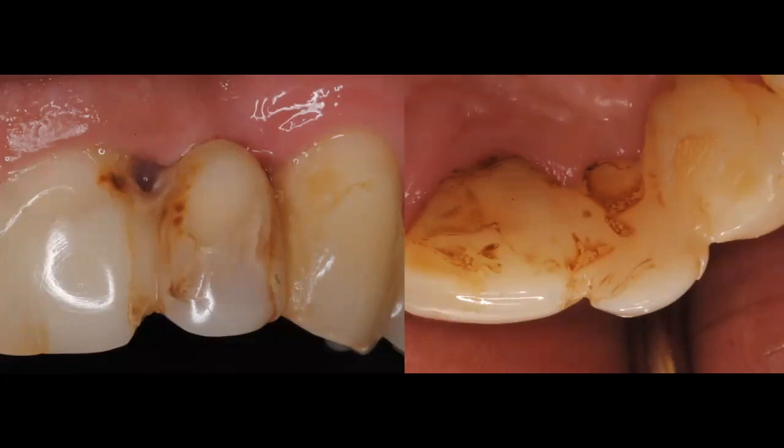You can see that this patient had lost tooth number 10, which is a lateral incisor. A previous dentist had bonded the actual crown of tooth number 10 to the adjacent tooth number 8, tooth number 9, and tooth number 11. You can see it from the facial view on the left-hand side and from the lingual view on the right-hand side. Patient was a smoker, and you can see some of the nicotine obviously staining this composite. This composite was there maybe for a little bit over a year when we received the patient in our dental chair.